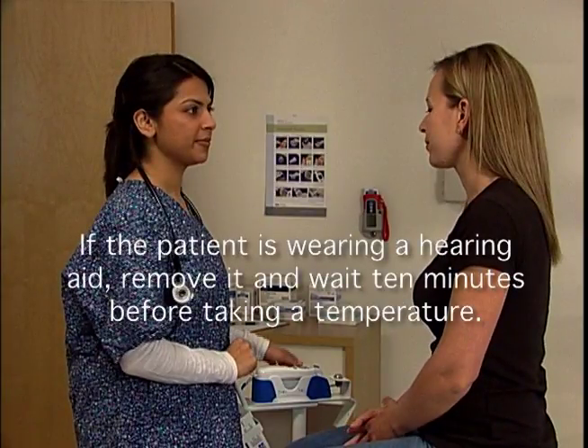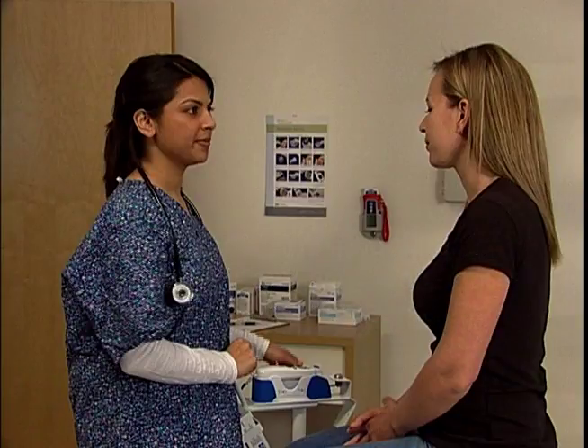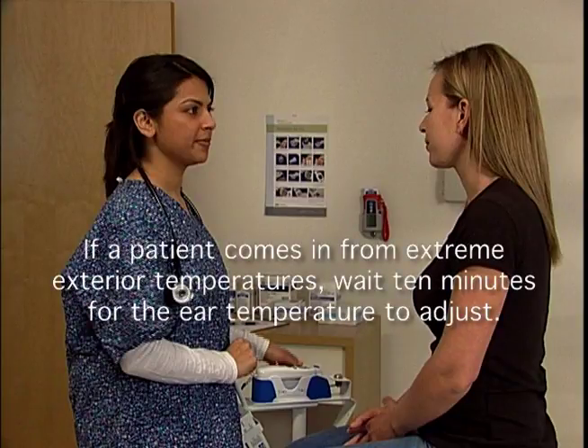If the patient is wearing a hearing aid, remove it and wait 10 minutes before taking a temperature. Patients coming in from extreme exterior temperatures may exhibit an inaccurate ear temperature; you should wait 10 minutes for the ear temperature to adjust.